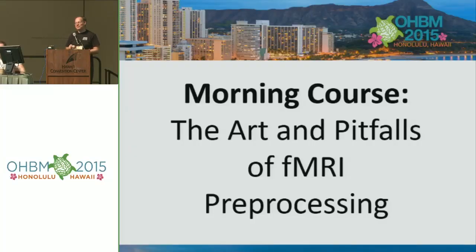Thank you. Can I follow up on that question? There are lots of hidden smoothing steps that we do for fMRI data. For example, if you do realignment, you may not notice, but the interpolation that you use for transforming and aligning everything is going to introduce some smoothing. Even though it's very slight, it is smoothing.